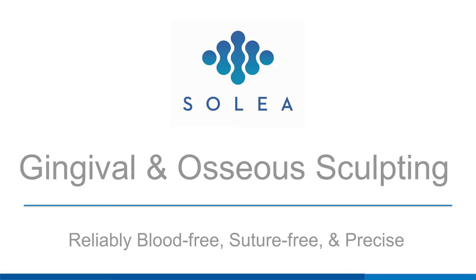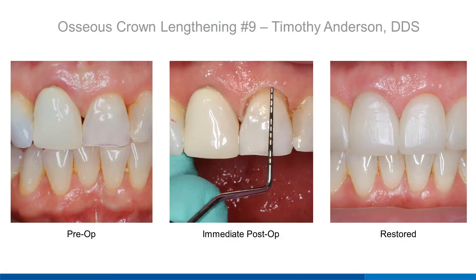Solea is virtually blood-free for soft and osseous tissue procedures. It sculpts tissue with unsurpassed precision resulting in rapid and predictable healing, seldomly needing sutures.